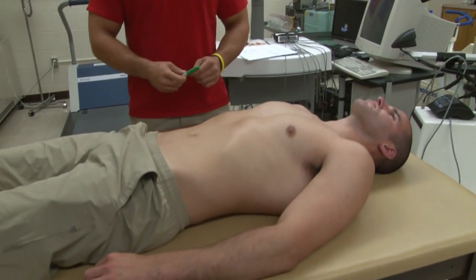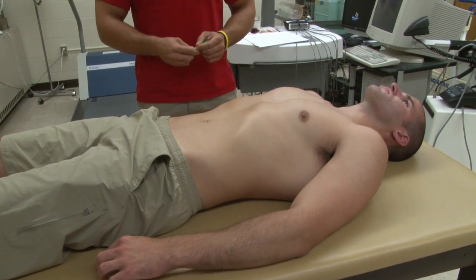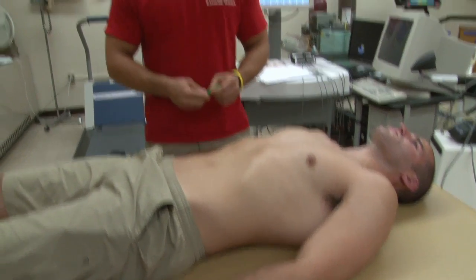Now I'm going to show you how to apply a 12-lead ECG to a patient. First, we're going to start by informing the patient to align in a supine position with his shirt off. This gives easy access to his skin where the electrodes are going to be placed. Then we're going to inform him to remove all electrical devices such as cell phones and pagers, because these can be picked up by the ECG monitor. We want the only electrical activity to be picked up from the heart — no external devices.